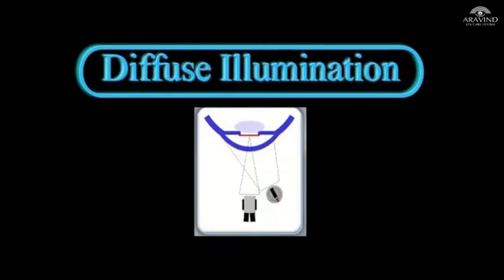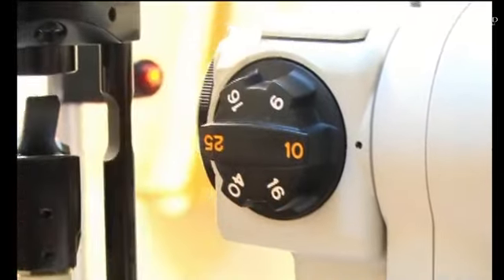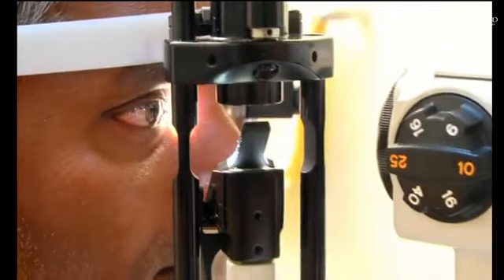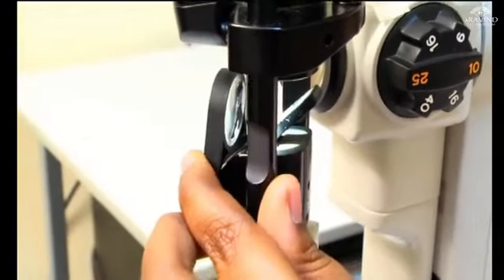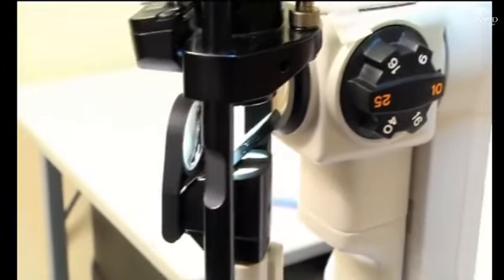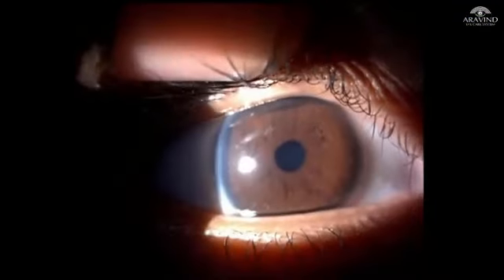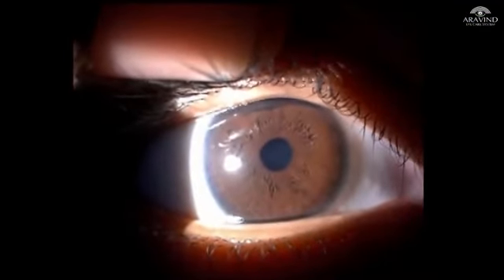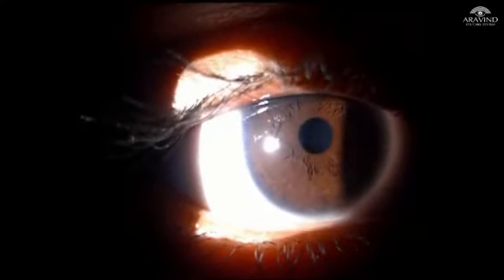To begin with any examination, start with diffuse illumination with magnification at 10x, wide beam, and longest vertical slit. A diffuser can be flipped over the light source if available, and then start examining from the lids, lid margin, conjunctiva, sclera, cornea, anterior chamber, iris, and the lens.